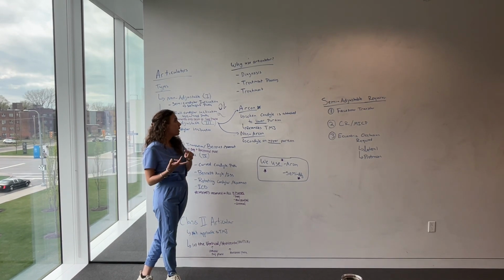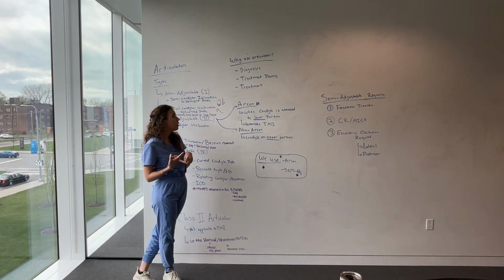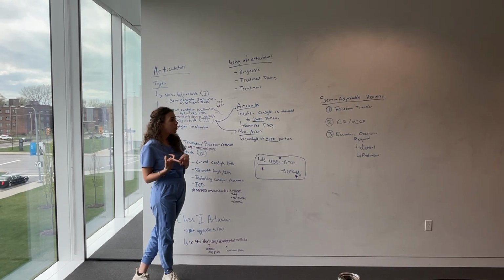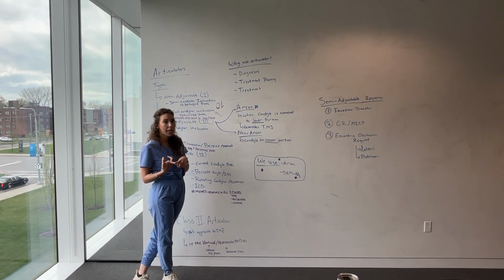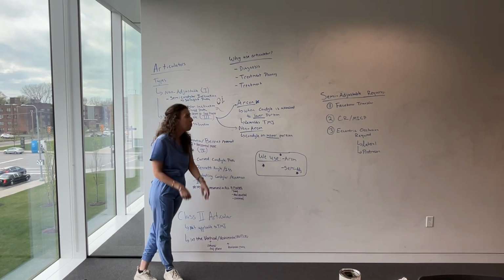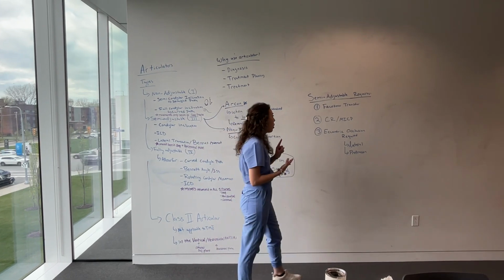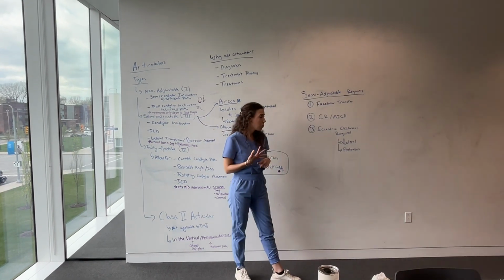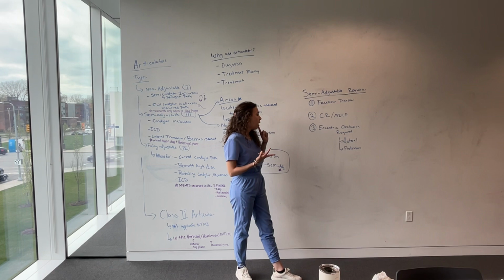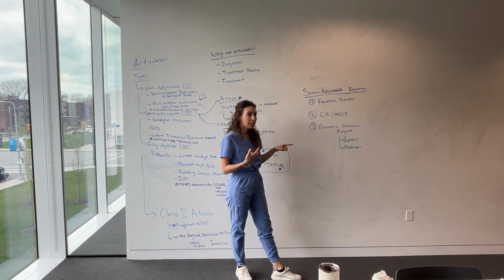For diagnosis, treatment planning, and just treatment in general, because it allows you to build the tooth outside of the mouth, so you're not just inside the patient the whole time. And then for semi-adjustable requirement, you need to do a facebow transfer on the patient. You need to measure the centric relation and MICP.